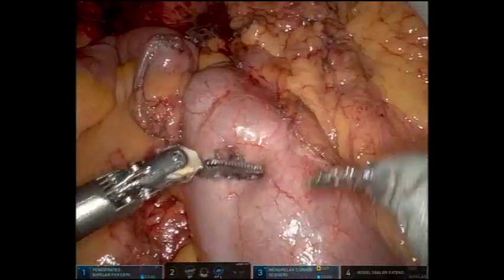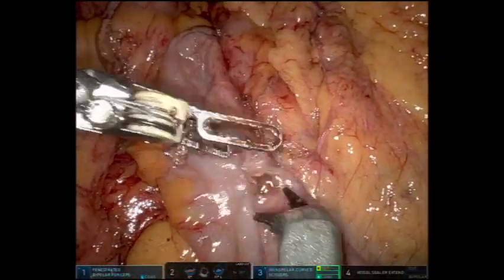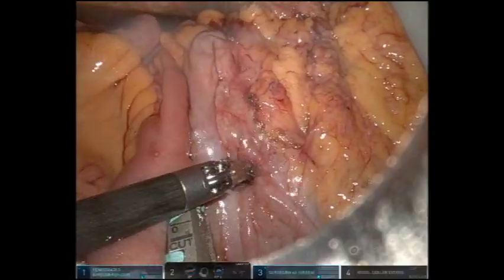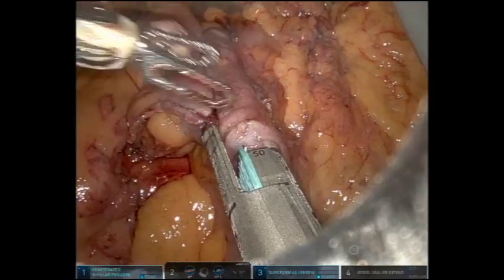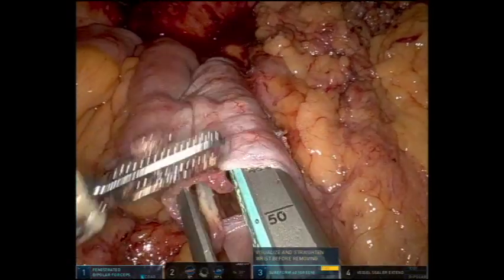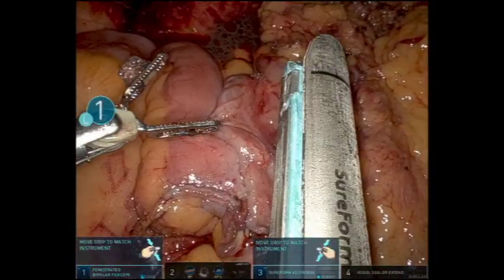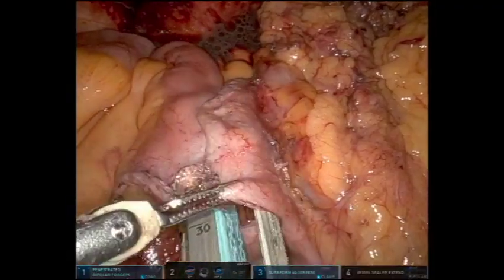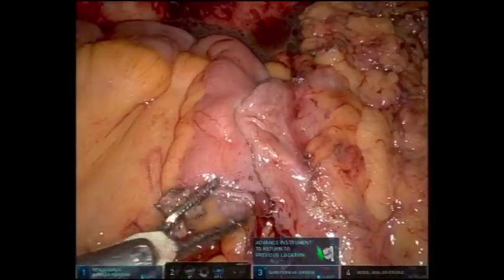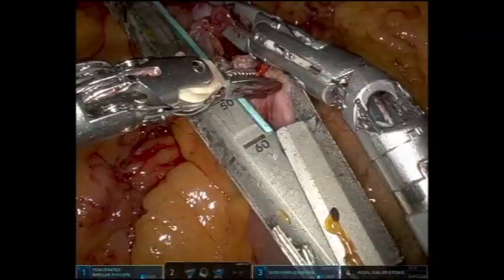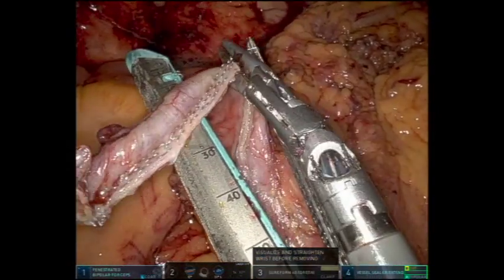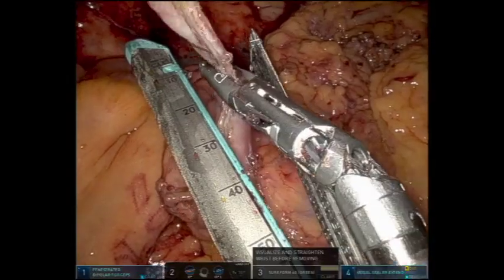A colotomy is then made in the transverse colon approximately 10 centimeters away from the staple line. A green robotic cartridge is placed into the terminal ileum and the transverse colon, and this firing of the stapler creates the ileocolic channel. The stapler is then reintroduced to lengthen the anastomosis to approximately 11 centimeters. With the help of an assistant, the remaining enterotomy is grasped, aligned, and a green robotic cartridge is used to close it.